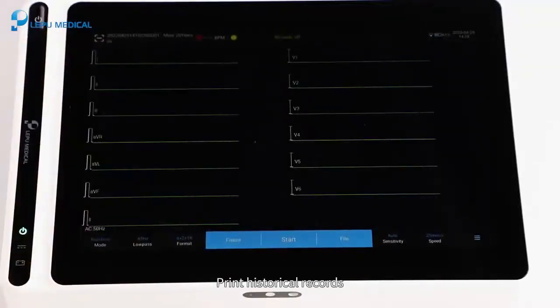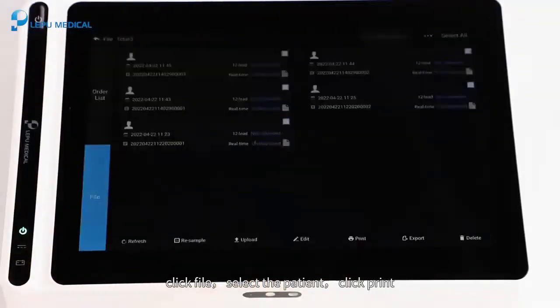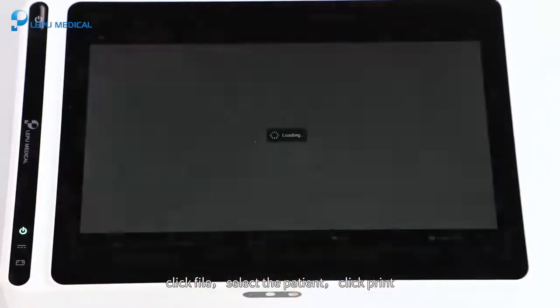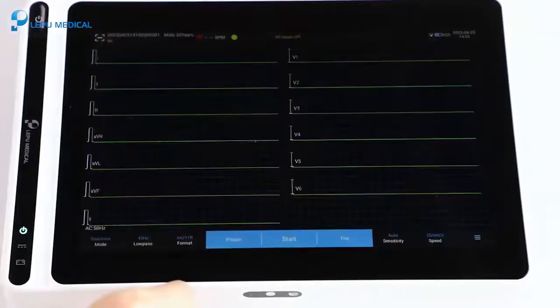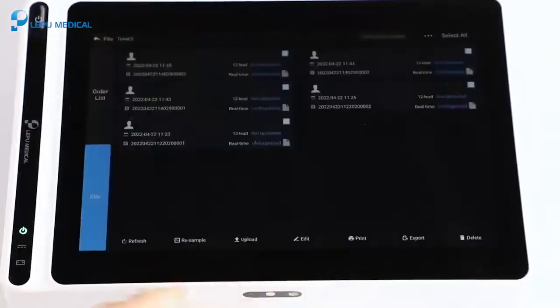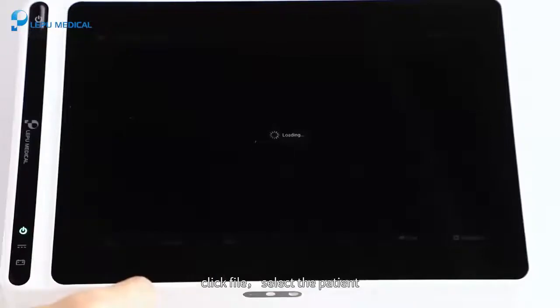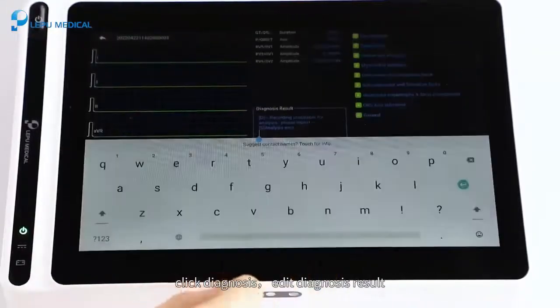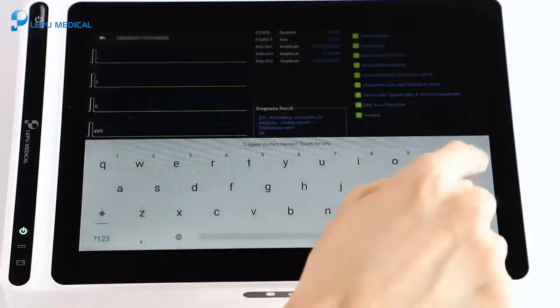Print historical records. Click File. Select the patient. Click Print. Edit Diagnosis. Click File. Select the patient. Click Diagnosis. Edit Diagnosis Result. Click OK.